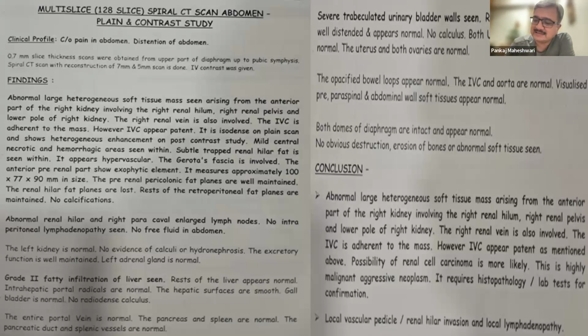Again, as far as PET CT scan is concerned, I would partly agree with you that the important thing to do in this patient would be a triple phase CT with a CT of chest. As far as FDG PET versus CT is concerned, the pickup rate for metastasis is nearly the same. Only very early bony metastasis and soft tissue metastasis are better picked up on FDG PET. But lymph nodal metastasis, local staging and lung metastasis are better picked up on CT scan.